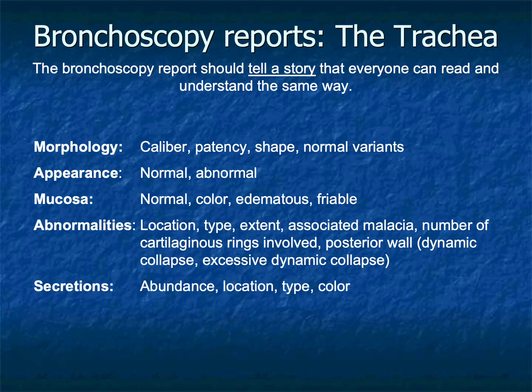Describe whether cartilaginous rings are involved, whether malacia is present, and whether abnormalities affect the posterior membranous wall. Finally, document airway secretions, including their quantity, location, and appearance. A structured description creates consistency and improves communication among clinicians caring for the patient.